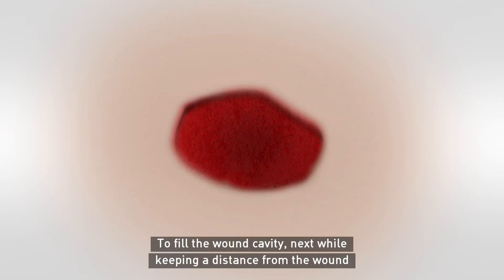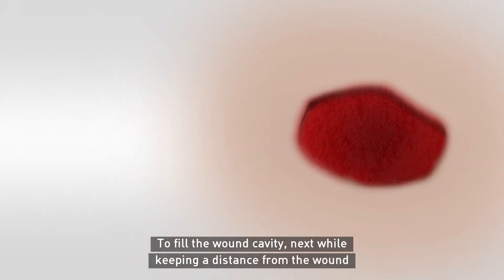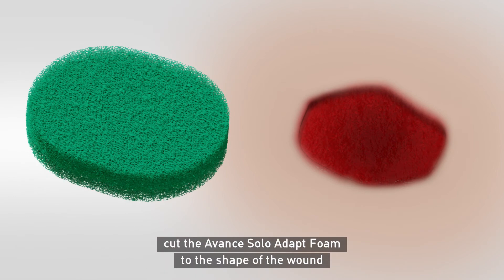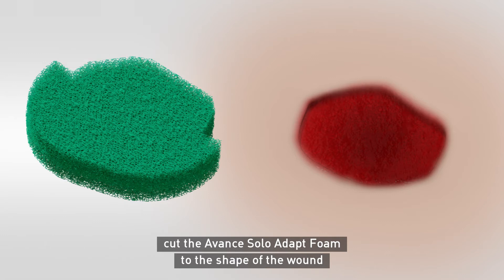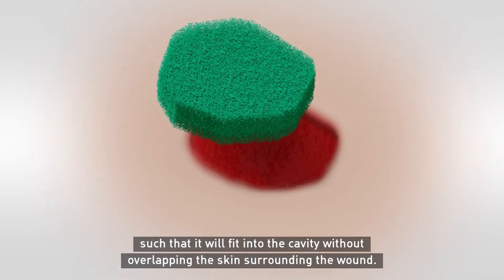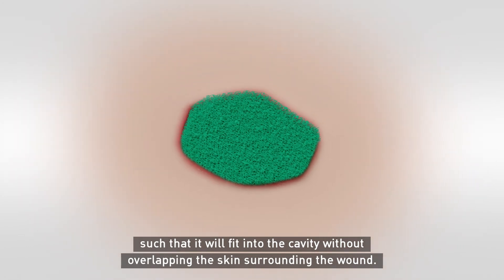To fill the wound cavity, while keeping a distance from the wound to ensure no fragments can fall into it, cut the Avance Solo Adapt Foam to the shape of the wound, such that it will fit into the cavity without overlapping the skin surrounding the wound.